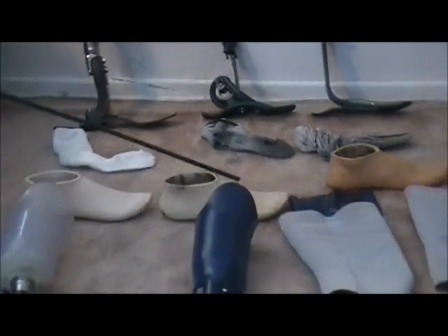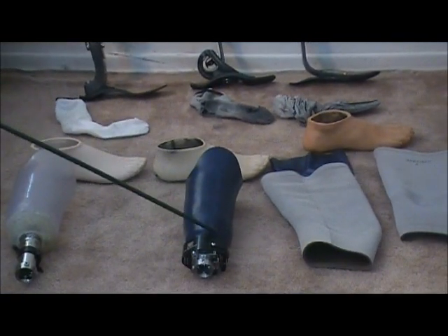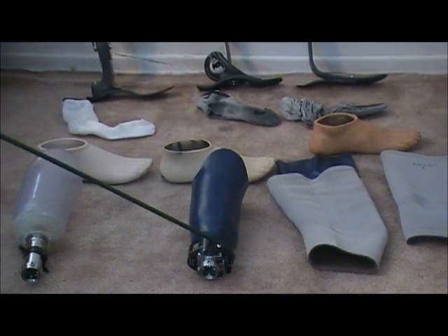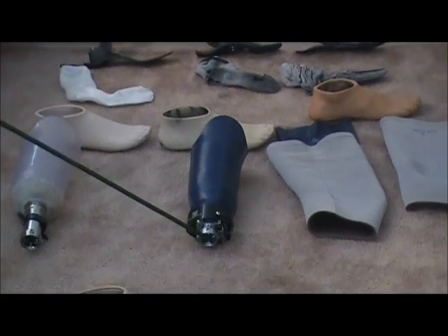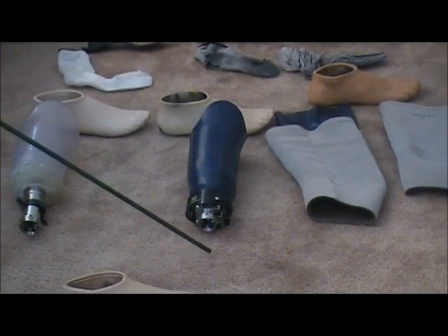This is a finished socket after the test socket — you'd have a finished socket that looks like this. This is what fits the residual limb. This has a LimbLogic vacuum pump on it and a female adapter at the top that you would attach the coupling to for alignment.